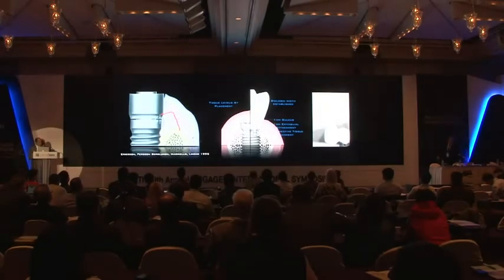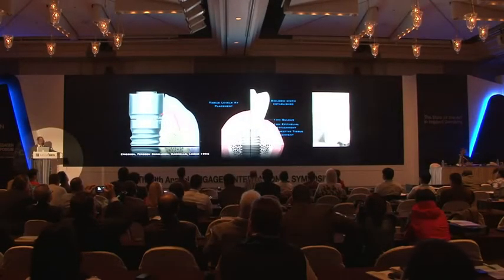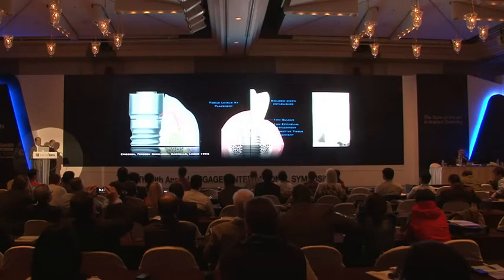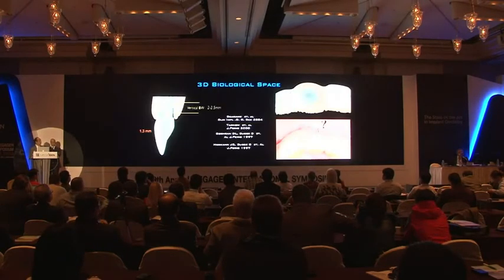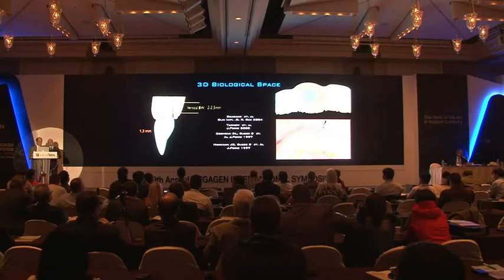But if we criticize when a crown is not precise, why? When we have no fit between an implant and abutment, and also the reabsorption of the crestal bone, in literature we speak about physiological reabsorption of the bone. Let's not forget that the reabsorption around an implant, unlike on the teeth, does not exist only vertically, but in a minor measure also horizontally. And this, for the aesthetic result, might be inconvenient.